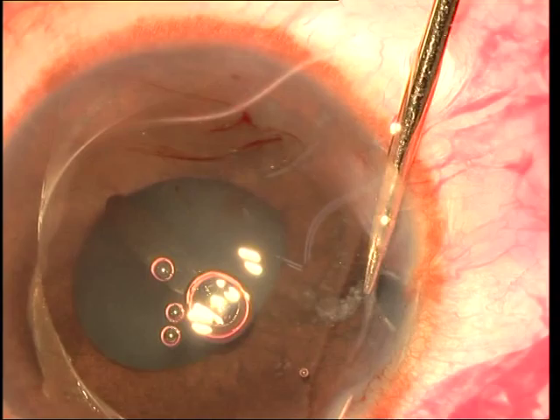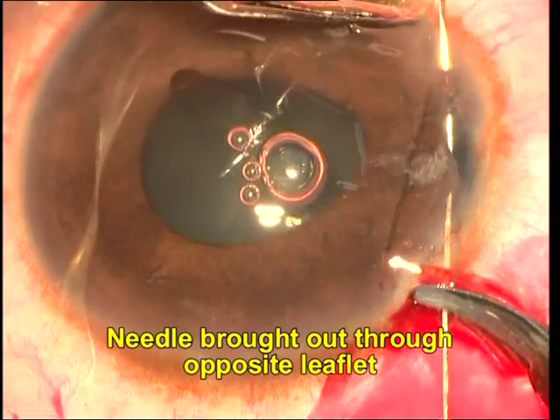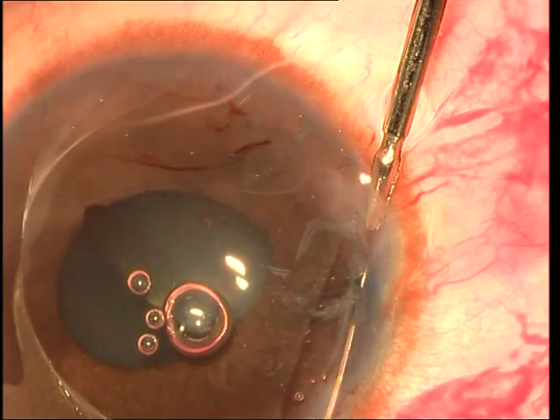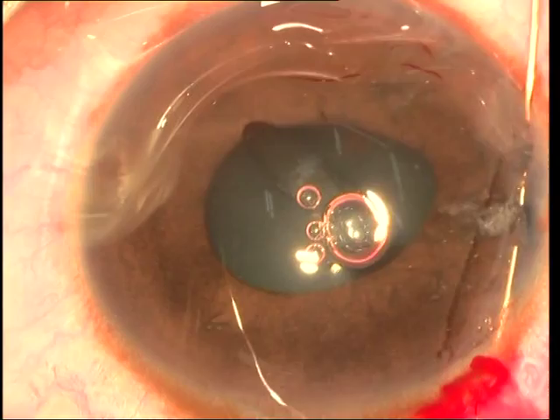This ensures that when you pass the needle in, as you're doing now, you do not touch the crystalline lens and damage it. The needle passes in through the first leaflet and then further onwards through the second leaflet of the iris before it comes out through the cornea on the other side. The needle is pulled out, carrying the suture along with it, which has now traveled through both leaflets of the iris on either side of the peripheral iridectomy.